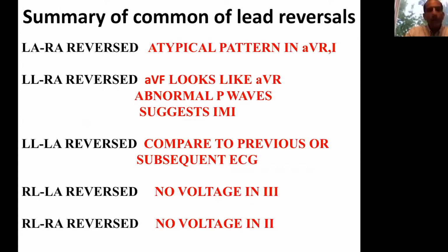There are different ways to do this, but if I start talking about lead switch, I can give you a whole talk on lead switch. So in the interest of giving a more comprehensive talk, I've just summarized different patterns that you can notice on ECG because of switching of the electrodes.